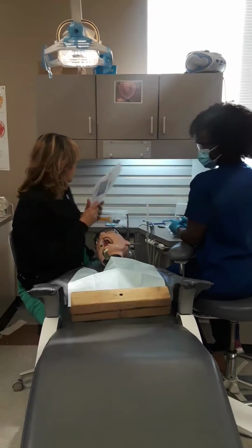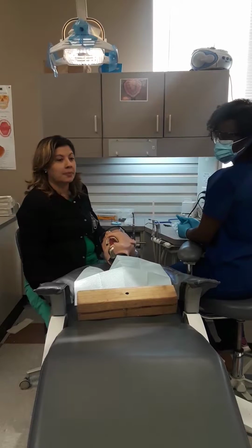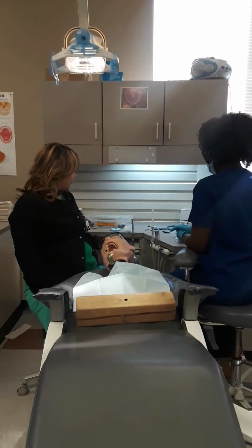Okay, let's see if we got all our setup here. Tell me what's on the setup. Somebody? Anybody? Sonia, what you got up there? Okay. High speed with 330 or 35 burs.